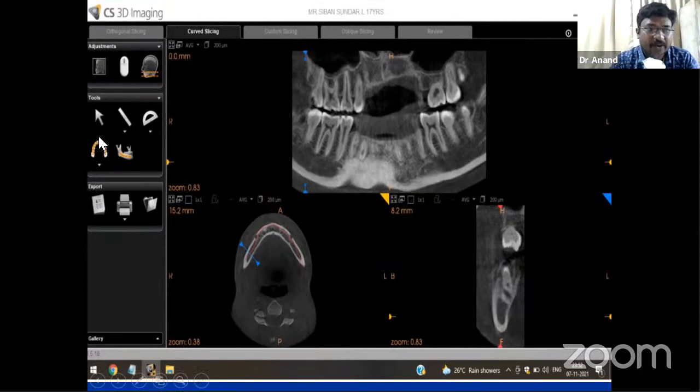See here, you have a tool called the panoramic tool. Can you see it here? They have the horseshoe shape. They have the panoramic tool. In the panoramic tool, you click on the area where you need to assess it properly. Like here, if this is a snapshot, I'm not going into how to assess the panoramic curve and all these things. So here they have made a panoramic curve in relation to the mandible, and the panoramic curve here is slightly clearly seen.